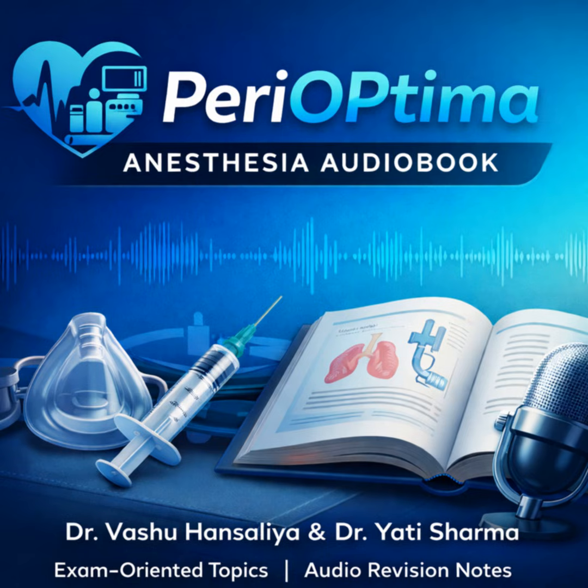The gas is wrong. Since the gas coming through the O2 flowmeter is actually N2O, and the gas through the N2O flowmeter is air, the patient receives a mixture made entirely of 2 non-oxygenated gases. N2O and air, which is mostly nitrogen. It's catastrophically hypoxic. This proves that the proportioning system protects the ratio, but it cannot protect the identity of the gas.